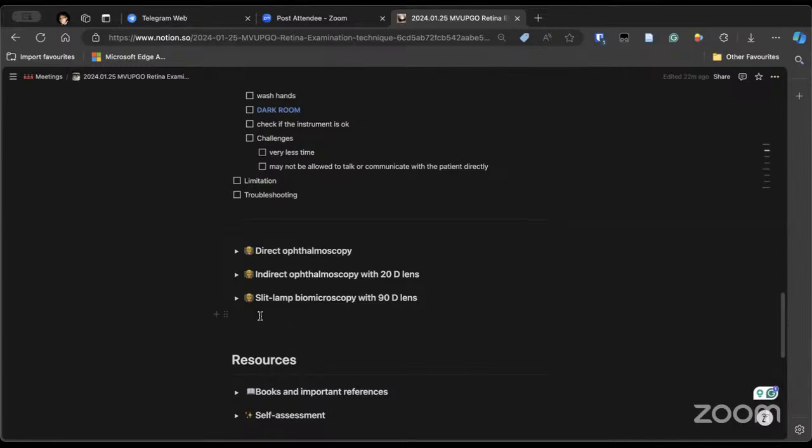And even if you do not know, you just go near the eye and rotate the dial. If it is a myopic patient, when you go to the plus dial, the image will be more hazy. That will give you the answer, and this actually comes with practice, rather than by saying it. You have to do direct ophthalmoscopy in at least 100 patients.